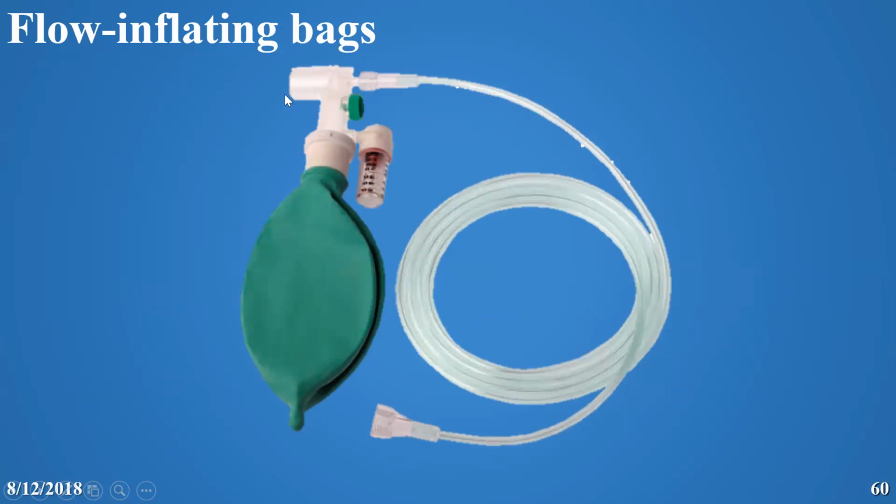So it needs a good seal, otherwise it will not inflate, and it needs flow. It can be oxygen flow, or it can be blended, but usually it's only oxygen flow. If the valve is broken, it will not be inflated. If there is no flow, it will not be inflated. And if there is no good seal, it will not be inflated. Because it needs a 100% airtight seal, it can provide up to 100% oxygenation. However, it will not work if there is a break or there is no flow.